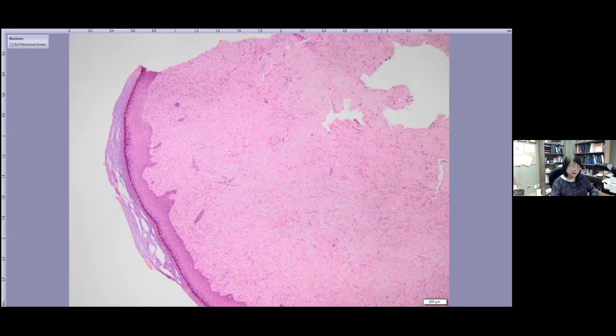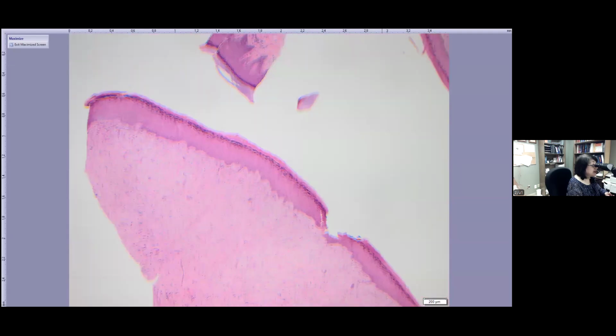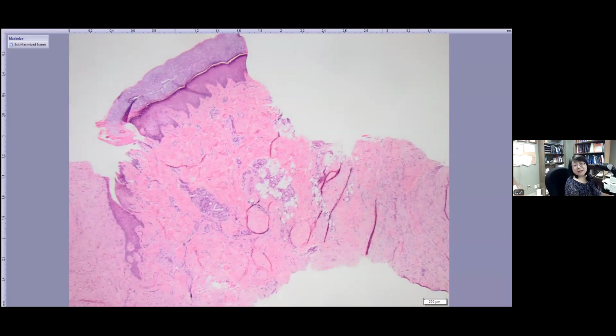So pink fibroblastic tumor. So keep looking. They are similar. Again, demonstrated those adnexal structures. This is the tumor. This is relatively normal dermal collagen here. So a little bit different. Normal collagen is hypocellular and pink, and tumor is more proliferative, has spindle cells, myofibroblastic appearance. I will go high power to show you.